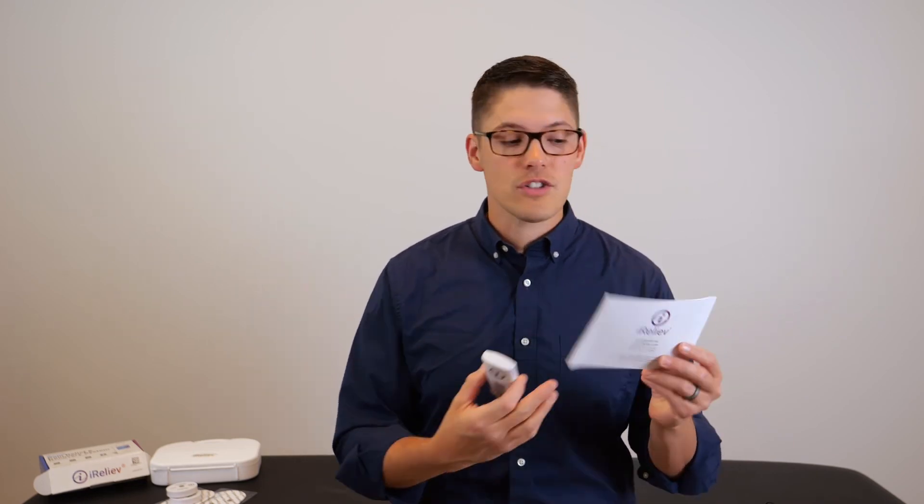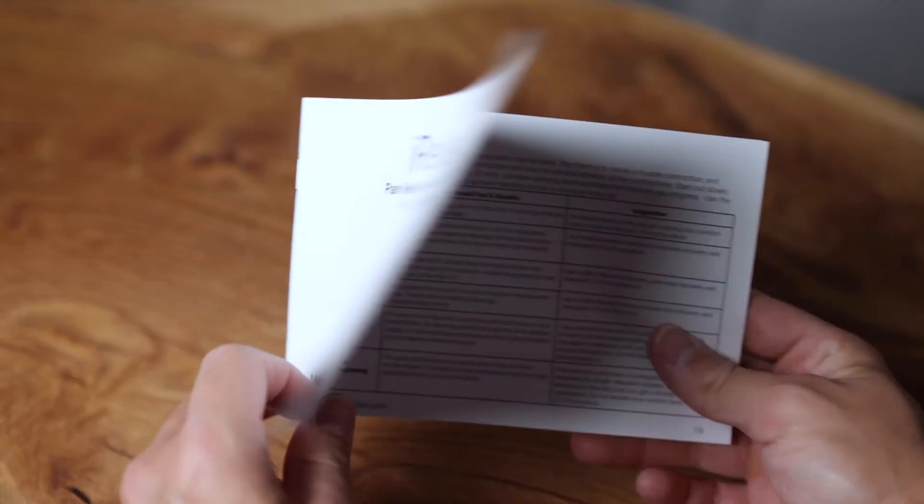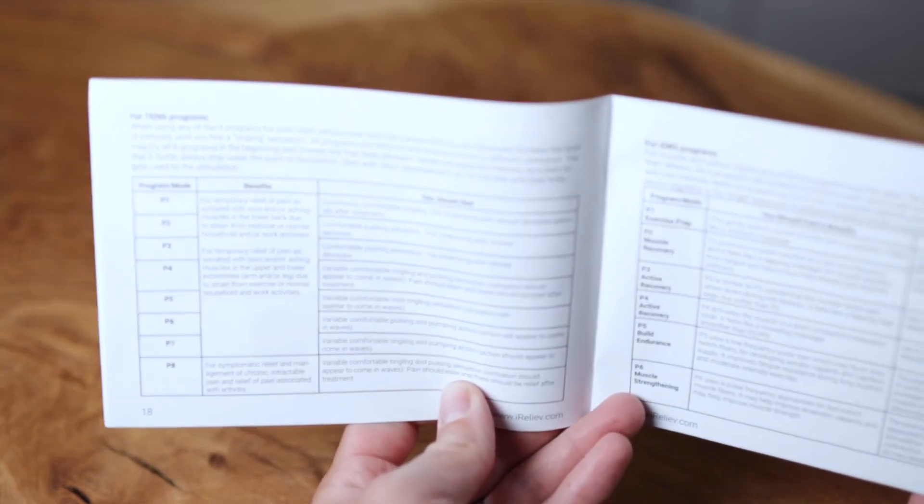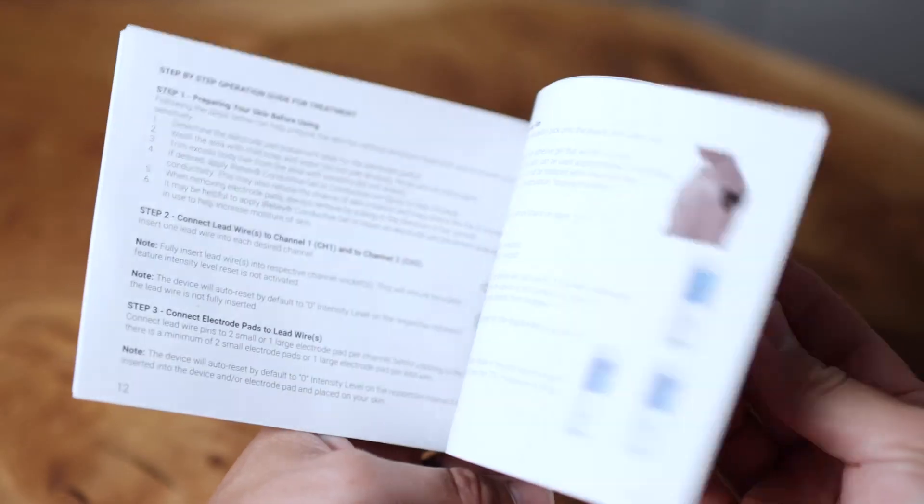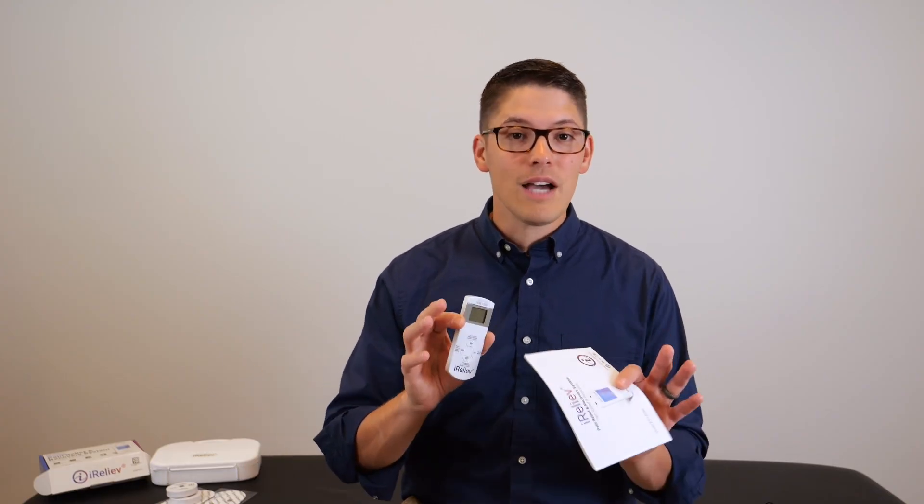Now, there are a lot of different settings on these units and one of the reasons I recommend the iReliev unit to my patients is because the instructions in the instruction manual are just so simple and easy to understand. They have helpful charts explaining each setting with clear recommendations on how to use the unit and I'll use more videos in the future to go into detail on how to use a unit like this for specific issues like back pain or shoulder pain. But now you just have a good idea of how to set up this unit and why you would want to use the TENS or select the EMS setting based on your goals to decrease pain or reduce swelling or even promote muscle recovery.